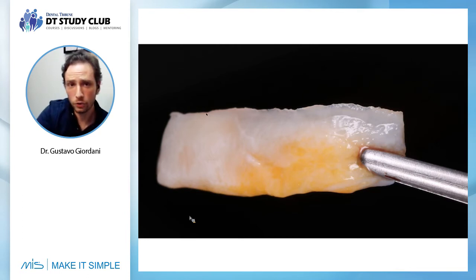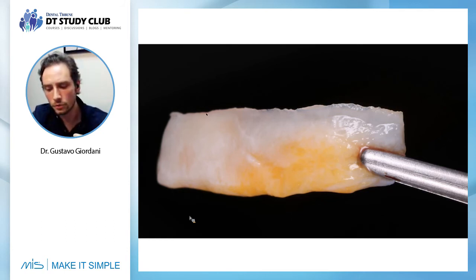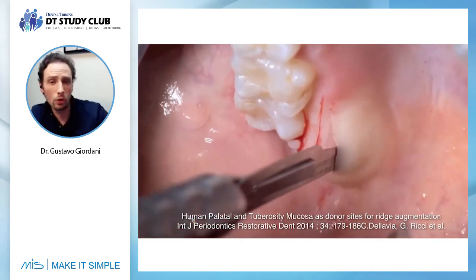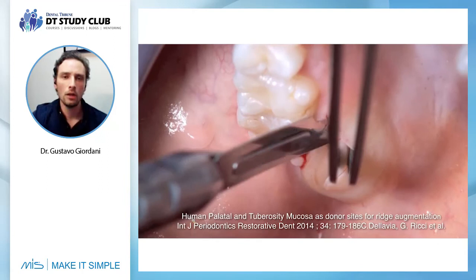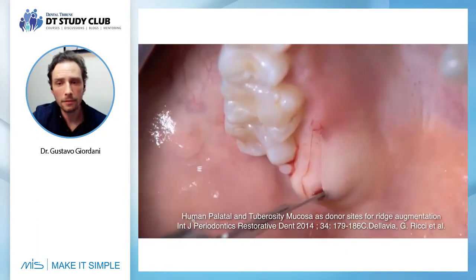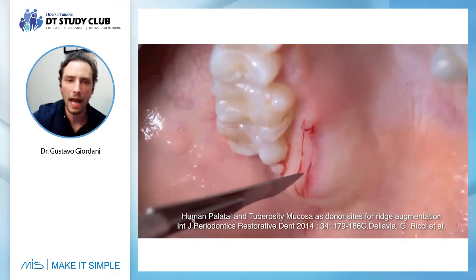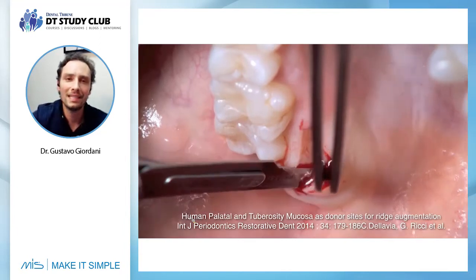If you go to the anterior part, with more fat, we're gonna remove some glandular tissue, which is a little bit not so stable. So this is a technique that sometimes doesn't give a very stable result in the long term. That's why we try as much as we can to go to the posterior area and use the same technique there. Because in the posterior area, we're gonna have very good tissue quality, with a lot of fibrous tissue. We don't have adipose tissue or glandular tissue in the posterior area, so you can remove a very good and very stable tissue.